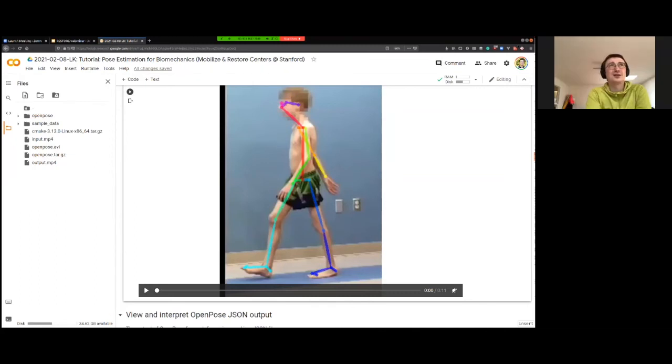That's a good question. There are two sources of error. First is that we have a 2D projection, and here the sagittal plane wasn't really sagittal. We were following the subject with the camera in fixed positions. The subject was walking, so the angle is actually changing. So it's not really directly correlated to what mocap gives in the sagittal plane. So that's the first source of error. The second is that those key points were not really annotated by biomechanists.